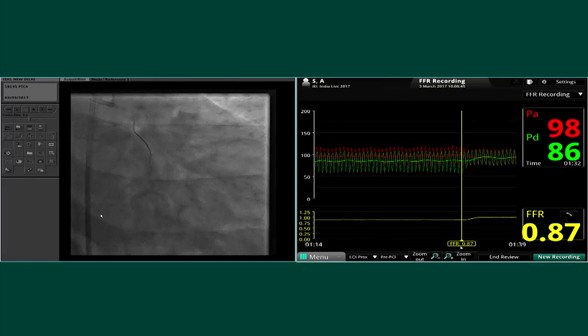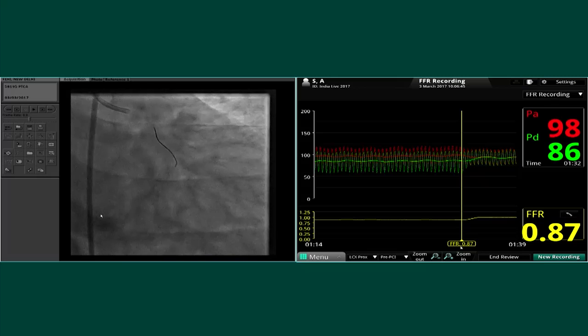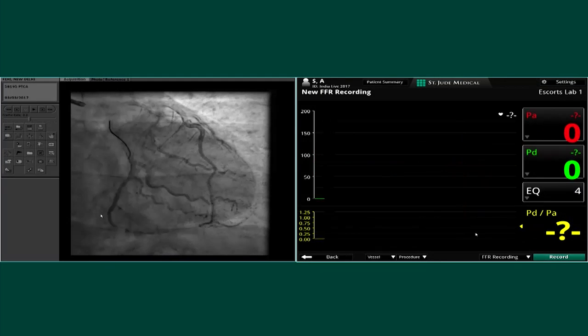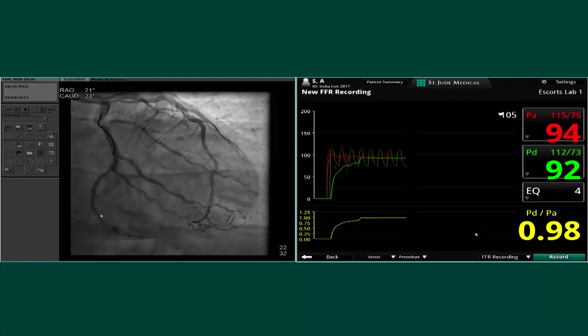Correct. Now look at the flow. I just want you to see. I'm taking an angiogram, and look at the vessel flow now. Absolutely brisk, and during the brisk flow, we've got an FFR which is negative.